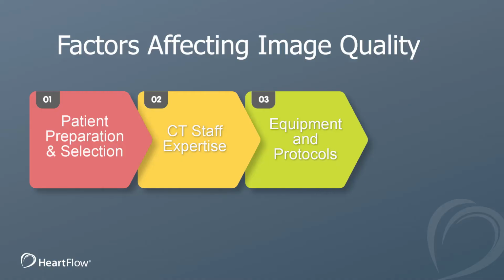So to recap, the reasons we may have excessive right heart contrast or poor contrast timing could be because too much contrast was used, or it could be because your pressure injector hit its limit and the injection rate was slowed down. In either case, the images run the risk of being non-diagnostic, so it's very important for you to optimize your contrast flow rates and injection time.